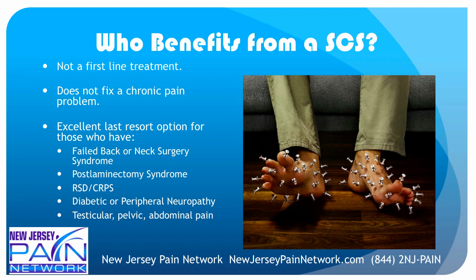Who benefits from a spinal cord stimulator implant? Well, it's not a first-line treatment. It is a last resort. It doesn't fix the problem, but it can replace pain with a nice tingling sensation. It's excellent for those who have failed back or neck surgery syndrome, post-laminectomy syndrome, RSD or CRPS, diabetic or peripheral neuropathy, post-herpetic neuralgia, and then evolving indications include testicular, pelvic, or abdominal pain.